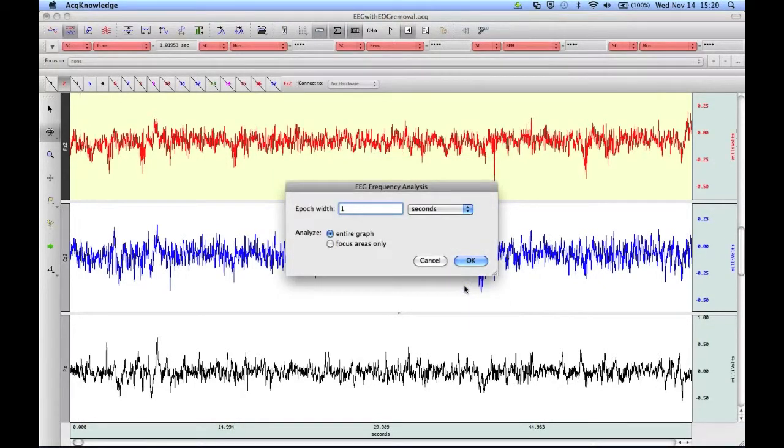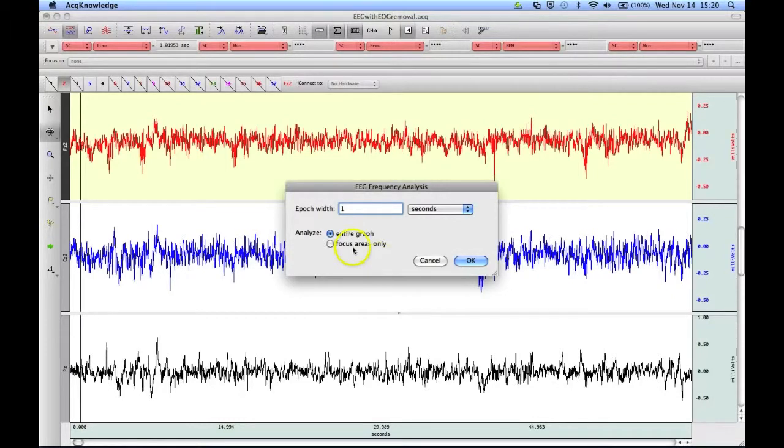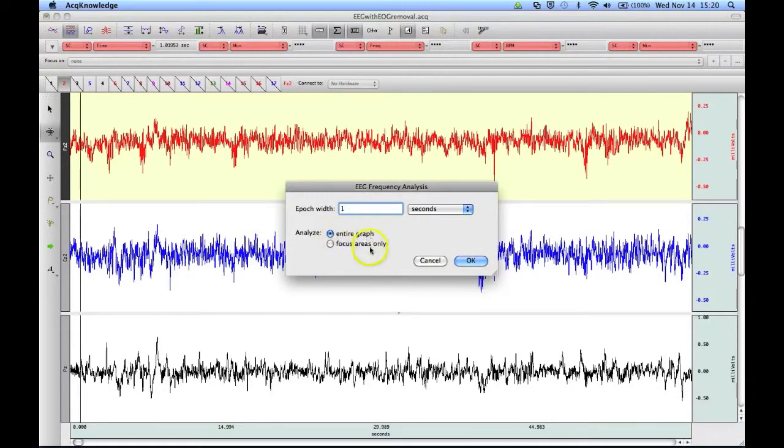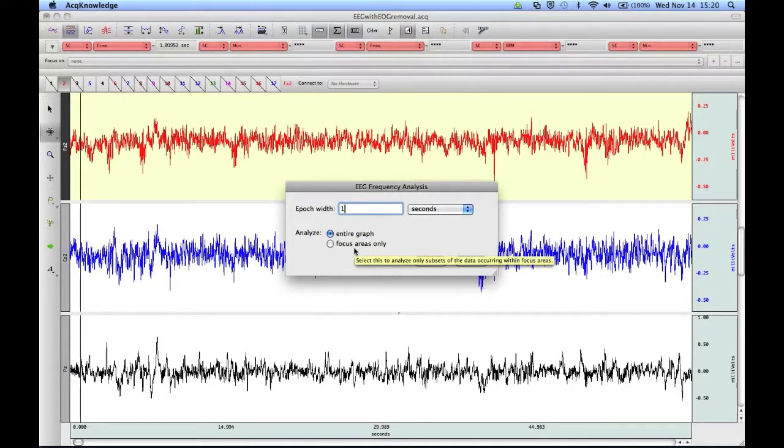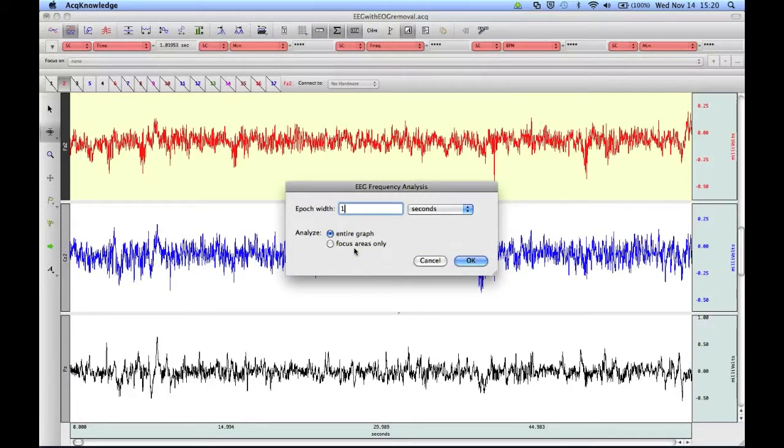We can then choose our epoch width, and we can analyze our entire graph or just a focus area. You can watch the screencast on focus areas to learn more about this powerful analysis tool.